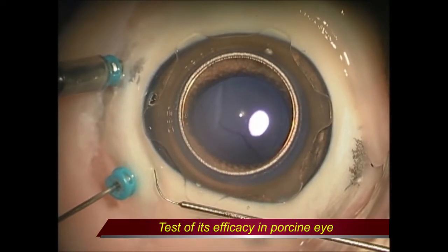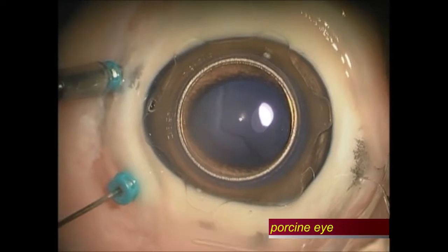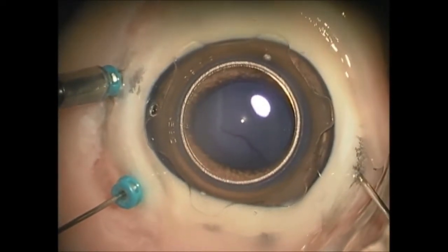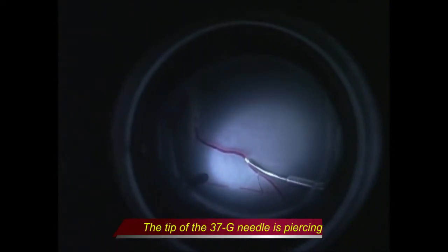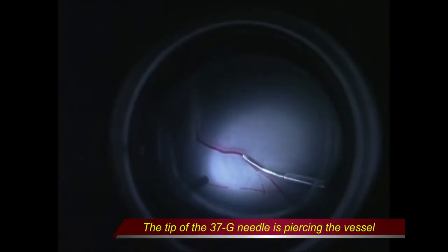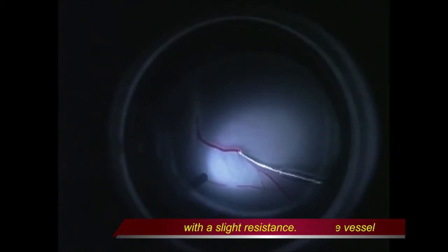We tested this device in an enucleated porcine eye. We placed two 25-gauge port trocars and performed another sclerotomy using a 23-gauge V-lance. The device was inserted through the 23-gauge sclerotomy site. The tip of the 37-gauge needle approached the vein and pierced it with a slight resistance.